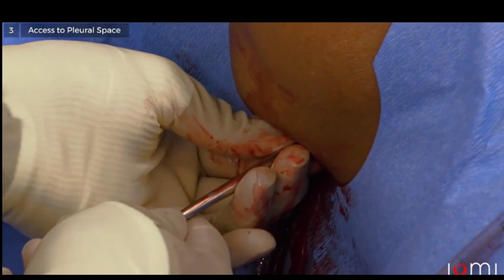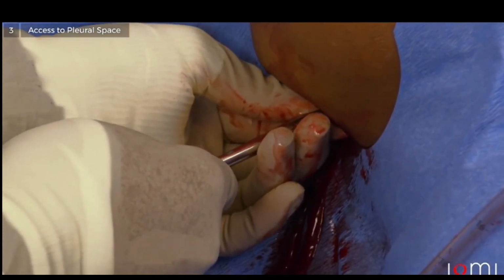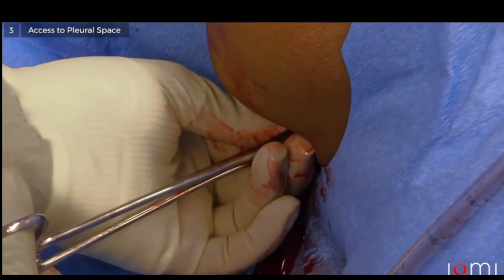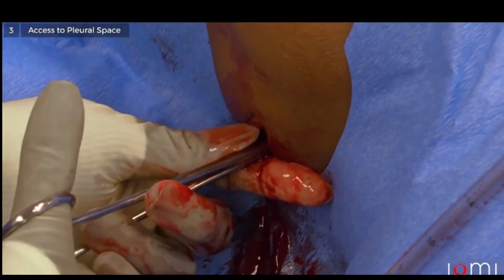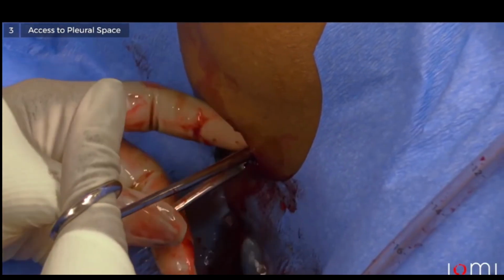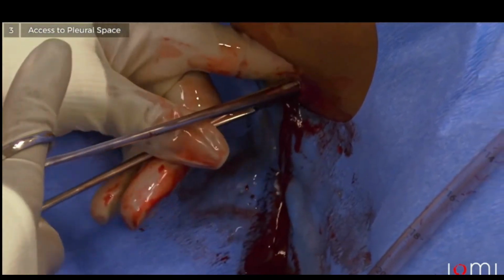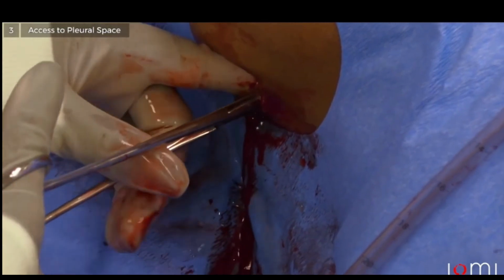Introduce the Kelly clamp in a controlled fashion into the pleural cavity using both hands to avoid injury to the lungs. Once inside the pleura, spread the Kelly clamp widely as you withdraw to create sufficient opening for the chest tube to be inserted.